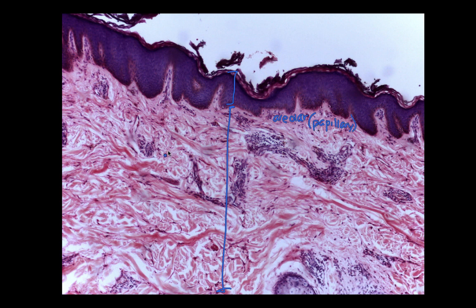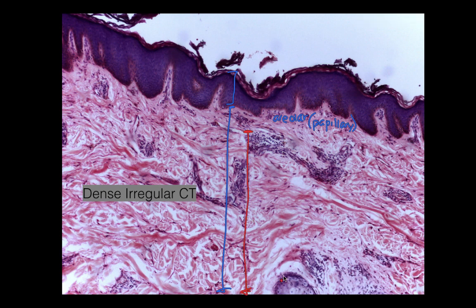Take a moment and see if you can recognize this connective tissue type down here. This is going to be dense irregular connective tissue. From about here down, that's the dense irregular connective tissue, and that layer is going to be called the reticular layer. So the papillary layer and the reticular layer make up the dermis. In this one slide we got both areolar connective tissue and dense irregular connective tissue.